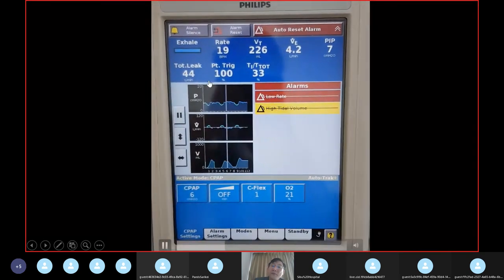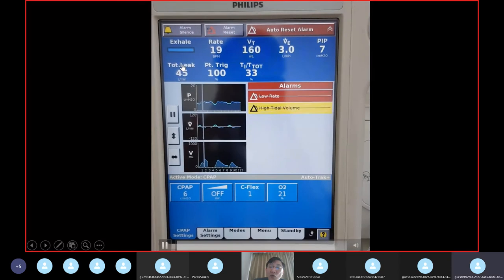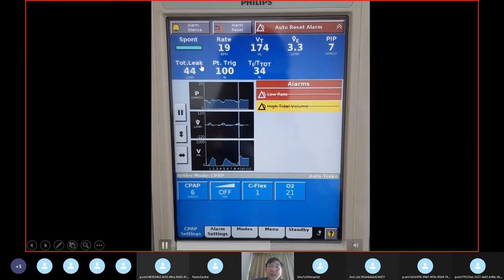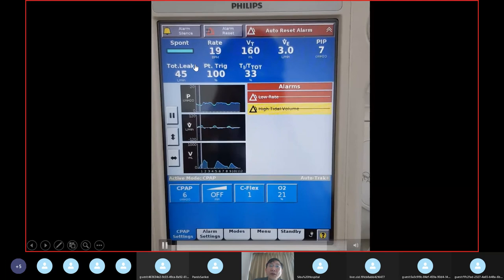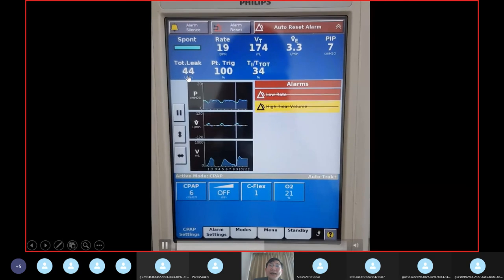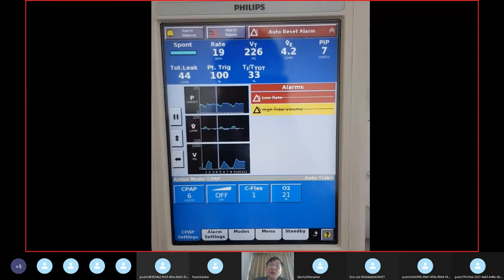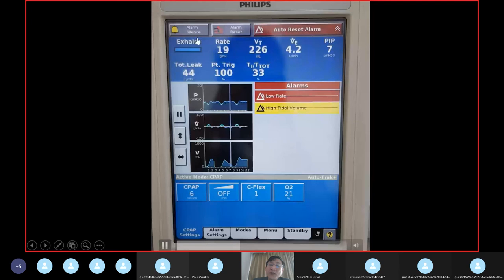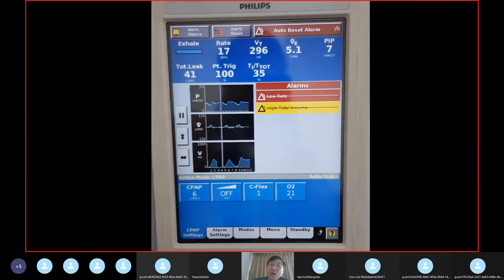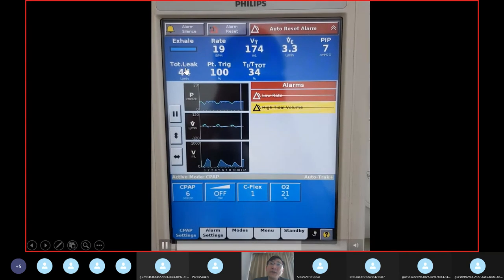The reason for the total leak, we're going to talk about later. So if you leak too much, you have to be very careful. If the system has leaked too much, you're going to notice that the humidification will be a problem if you do not use the heated wire chamber type. Because if you have too much leak, that means the flow is very high. If your flow is very high and the chamber temperature does not increase, the air they're going to deliver to the patient is going to be very dry and cold, okay? So this is what the important things you need to look into, right? So if you leak too much, the air the patient receives is going to be dry and cold, especially when you use only the heater chamber without the heating wire to monitor the humidification.